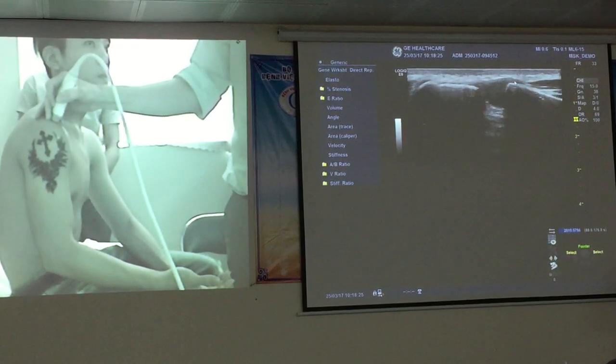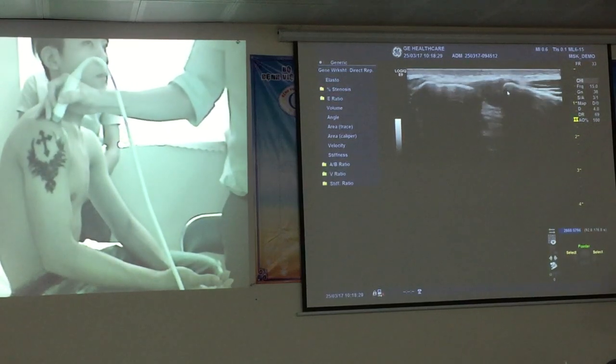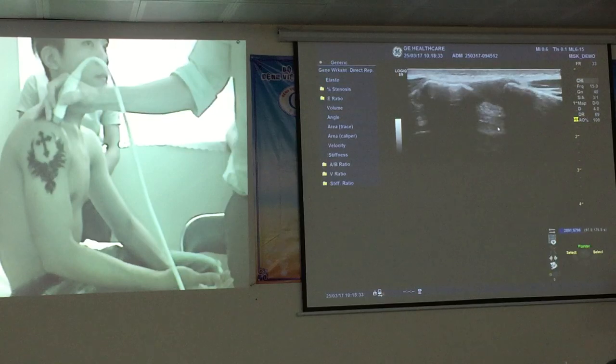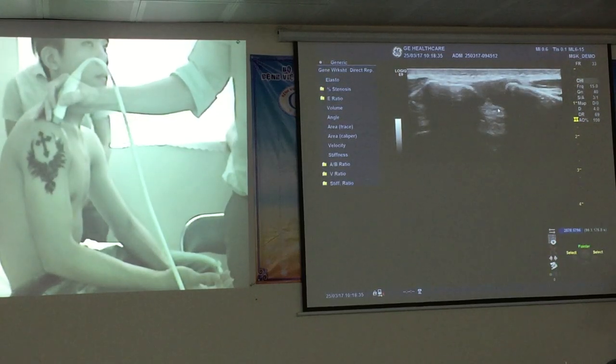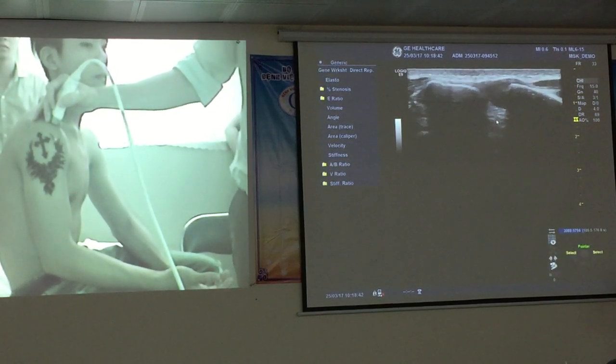And you can see here that this capsule is nice and smooth going over the top. And in this patient, you can actually see down into the subacromial space. So you can see that there's no real encroachment of that joint down into that tunnel.